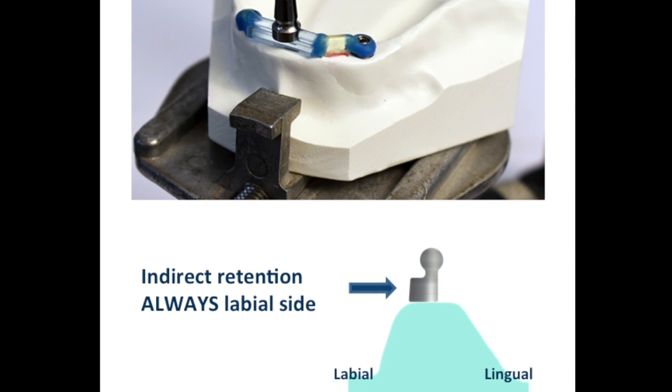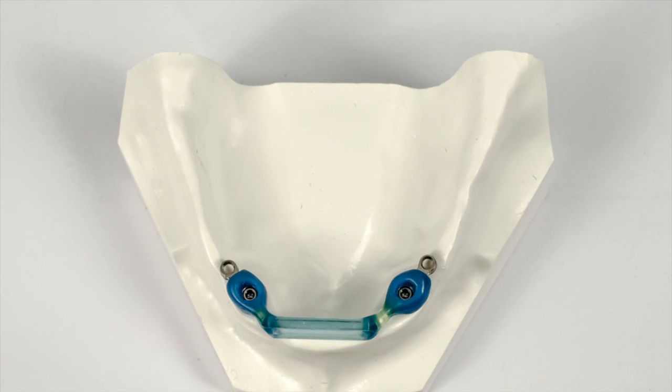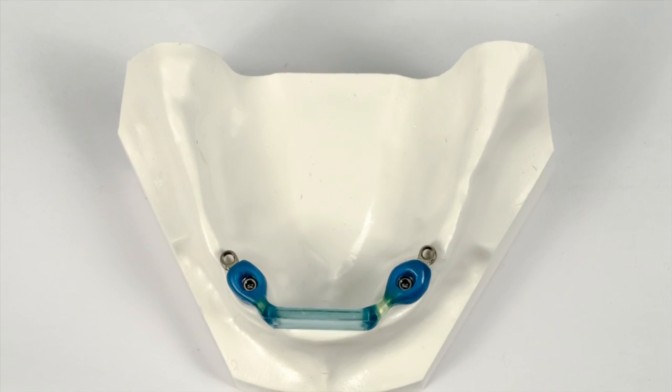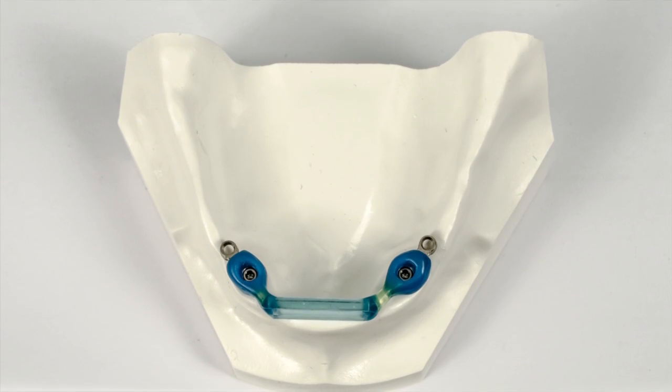To ensure that the bar was under the denture teeth, I had to move the bar toward the labial a bit. I used 2 short Hader bar sections to accomplish this, but you could just use wax.